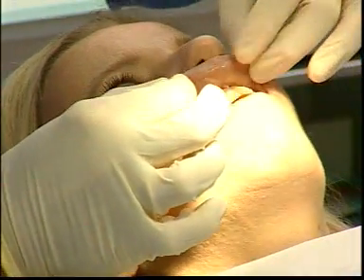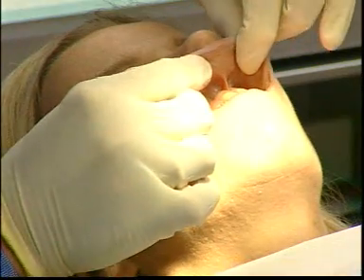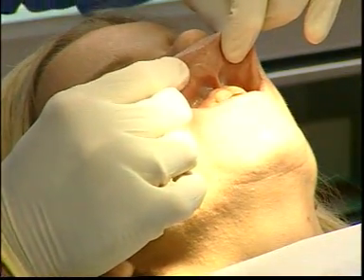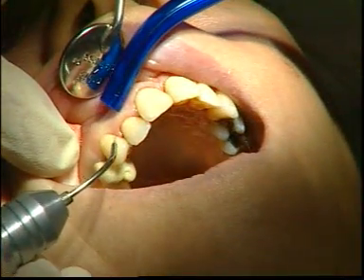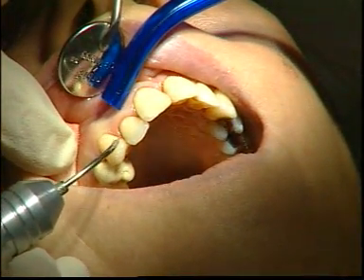In this young patient, we are performing a combined laser periodontal treatment with vestibuloplasty in the upper incisor region. The Aura laser jet is set to the S program.